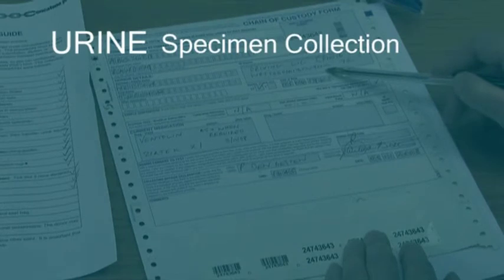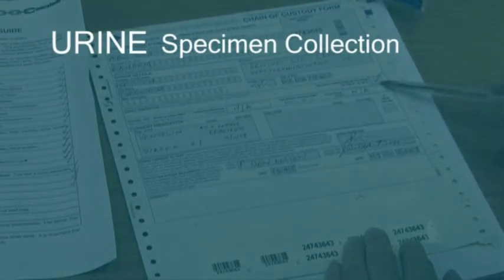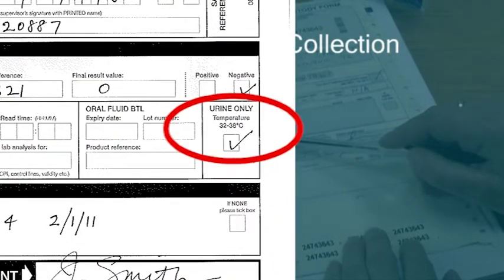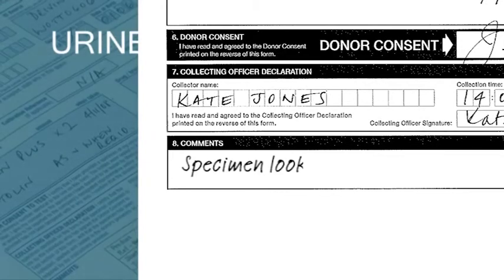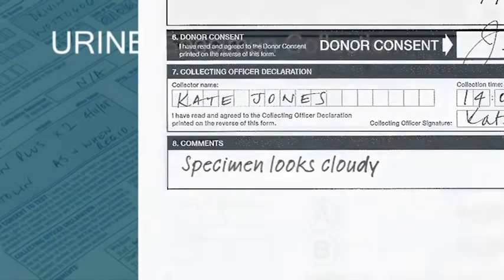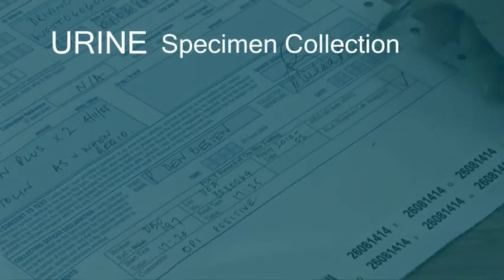Check and double-check the chain of custody form to make sure you have completed all the sections. You must remember to tick the temperature box. If the specimen looks unusual, colour, cloudiness, etc., make a note of this in the comments section. When the chain of custody form is complete, you can then sign and date the collecting officer section.